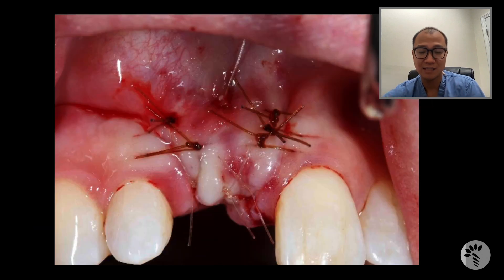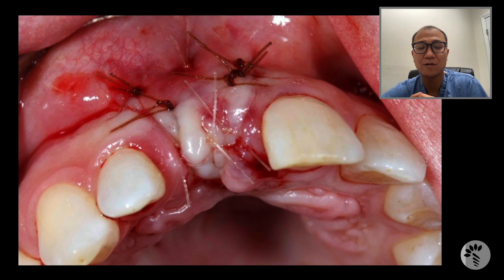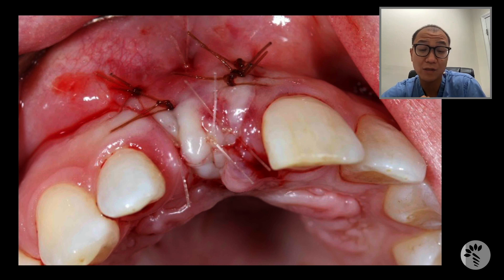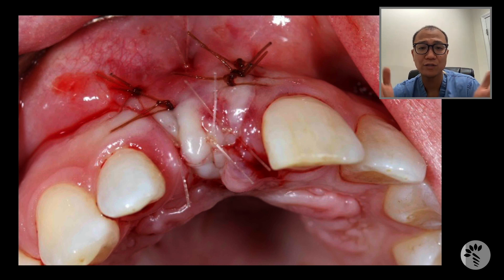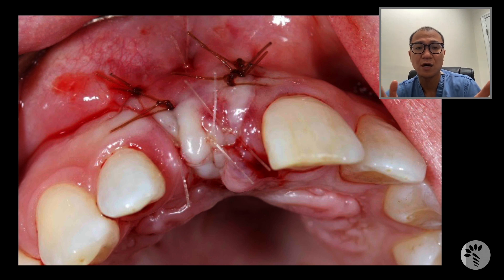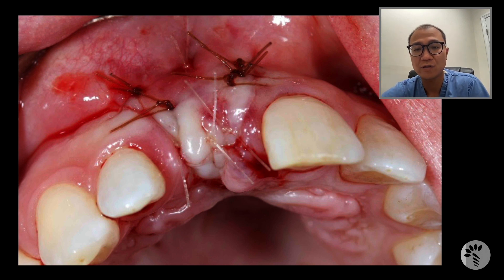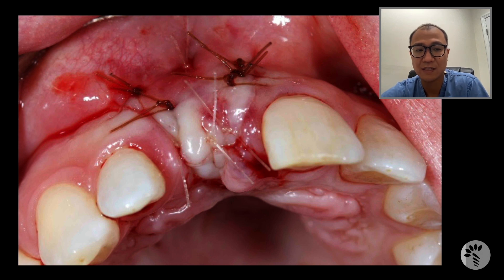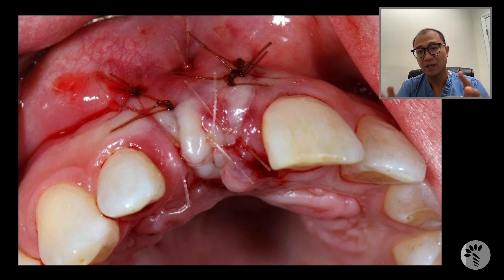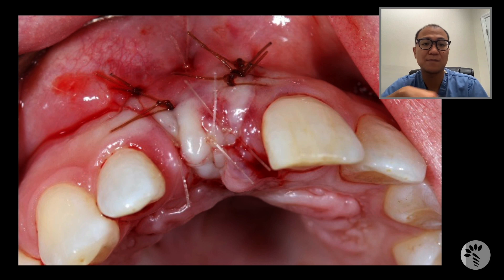After that, I simply closed the flap back, and this is how the case was finished. I used chromic gut sutures on the vertical incisions, and monocryl sutures on the crestal aspect. She had a flipper, and I wanted to make sure the flipper fit back in place.